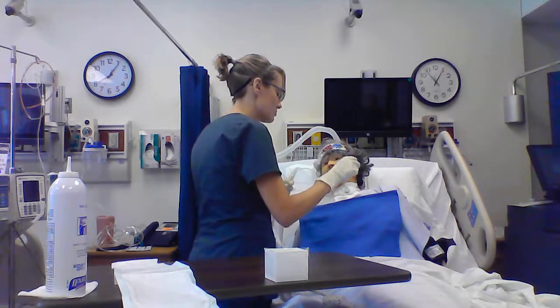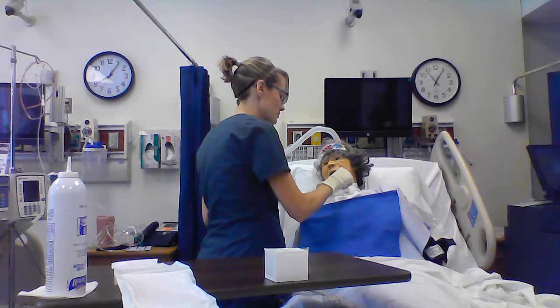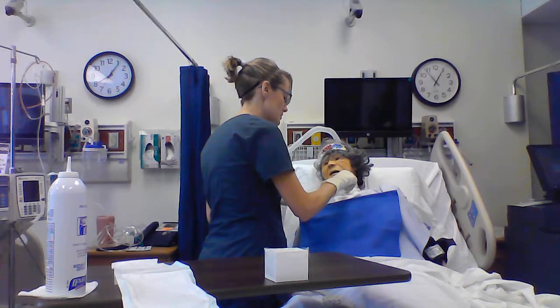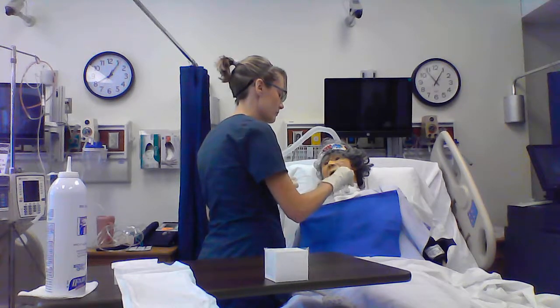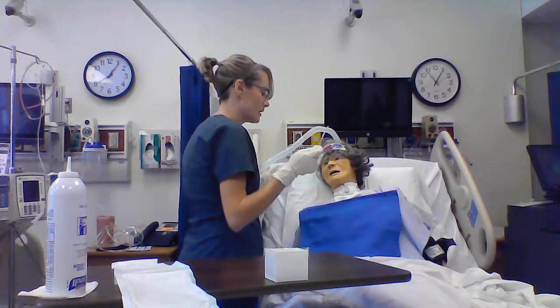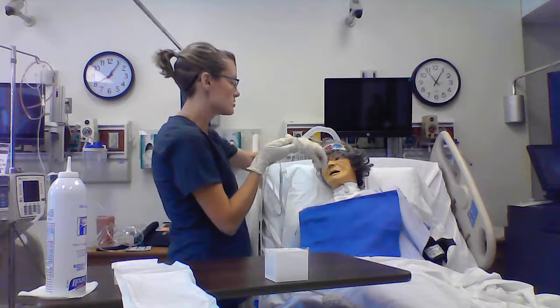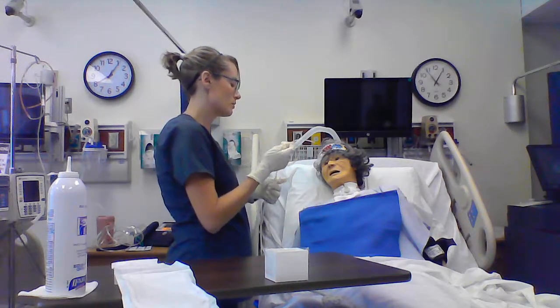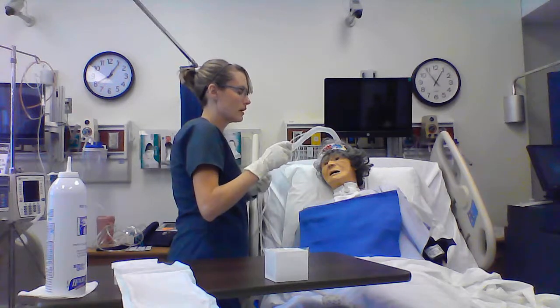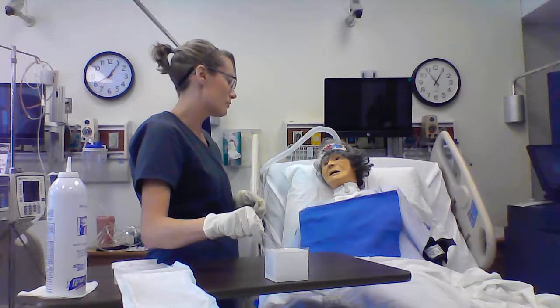So as I go down into the trach, I want to make sure that I don't have suction, and I go down until I meet resistance. And then intermittent suction as I come back out. And then I can give her a break if she needs. I can lift the oxygen mask back down to reoxygenate her if her sats are starting to deteriorate. Give her a break for about 30 seconds, and then I'm going to go back down again. So I'm going to clear out my catheter again.